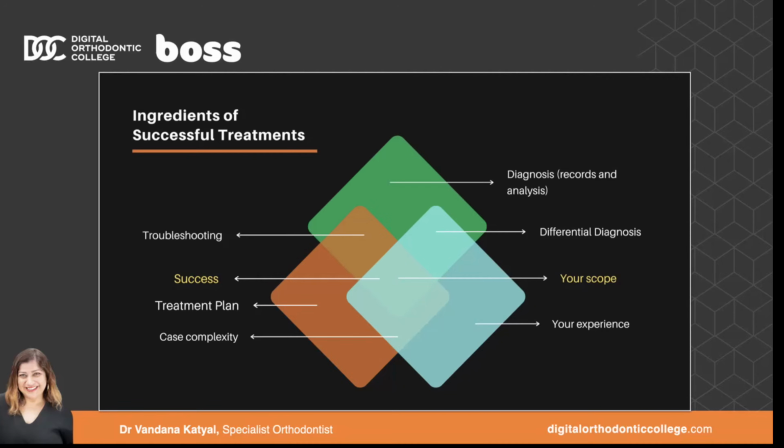Well, firstly, you've got to have a strong foundation in diagnosis, right? That's your record taking and analysis of those records. Then you've got to have a strong foundation in working out a differential diagnosis. You need to know your scope. You need to work within your experience. You need to understand case complexity, treatment planning, and understand troubleshooting. All of these will lead to success.